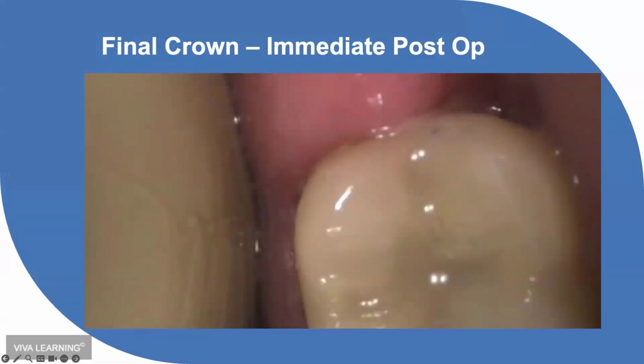Absolutely not. And the reason is because you're ablating, but you're not heating, you're not charring. You're basically cutting the surface of the bone, but compare that with something that had friction or the way a diode laser cuts with heat. Absolutely, I'm worried about dry socket, but not with this. In fact, this makes doing your degranulation of the extraction socket simple. I've even used this for a little broken root tip. I can trough the bone around the root tip, or I can shoot directly into the socket and laser away the final parts of that root tip because it'll ablate away the actual tooth structure. And then you can clean it up that way. So very, very simple to do that.